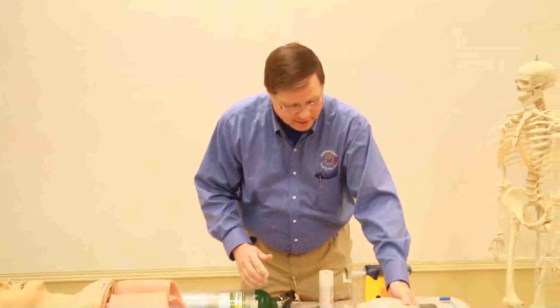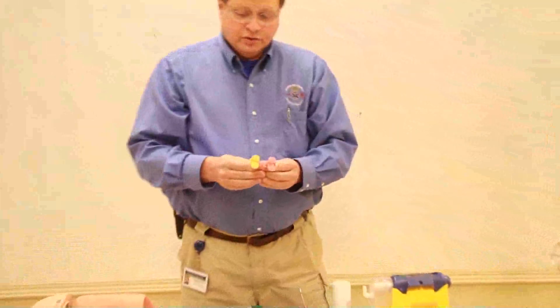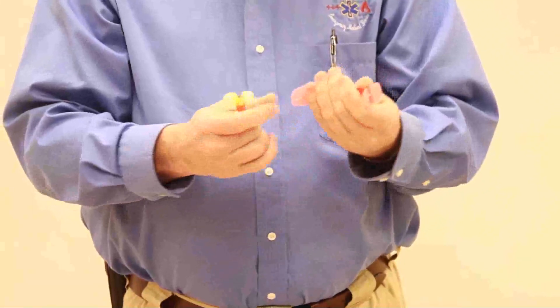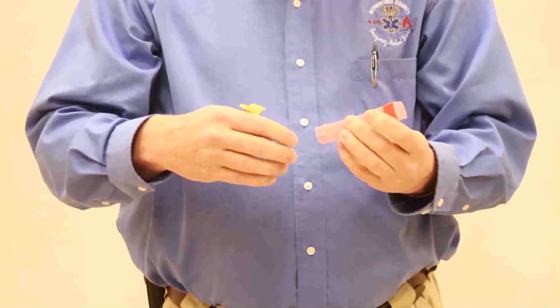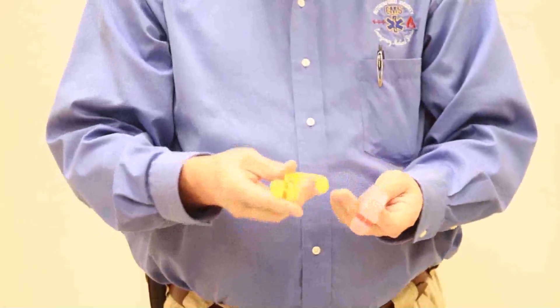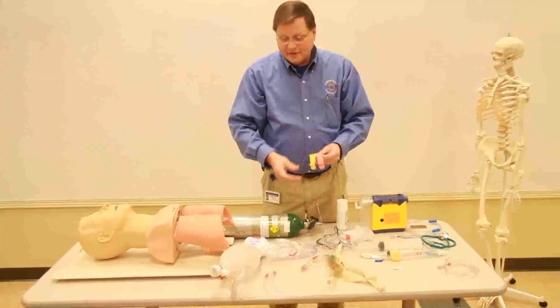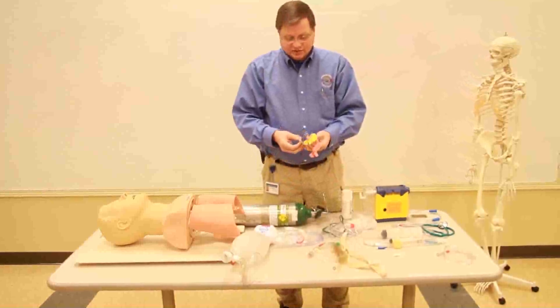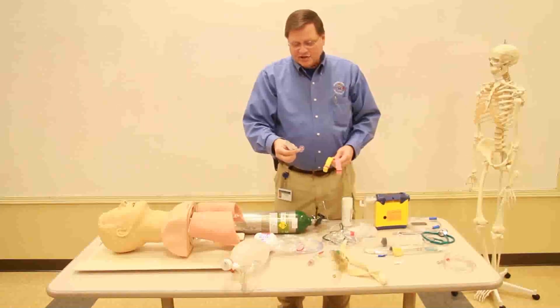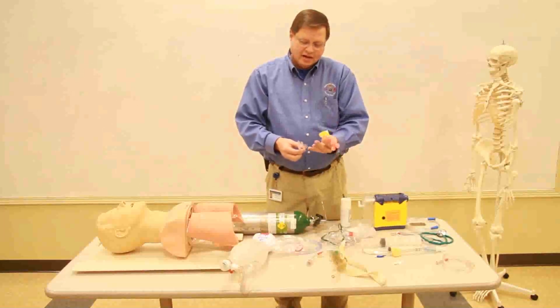The oropharyngeal airway is only used in the patient with no gag reflex. The problem is when you hit the gag reflex, they will regurgitate and vomit, and then you'll have vomitus in your airway — and that's never a good thing. They come in different sizes. The nasopharyngeal airway comes in different sizes, different lengths, and different french sizes, which is basically the diameter of the airway. You can use this in the patient with a gag reflex because it doesn't touch the back of the pharynx and cause the patient to vomit.